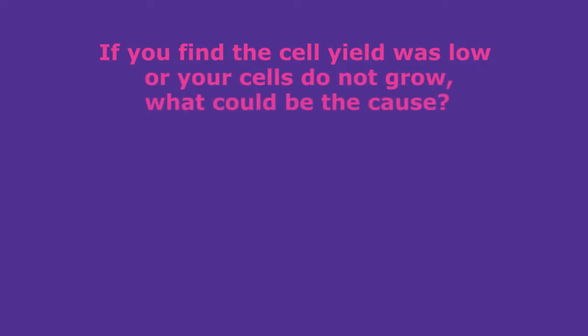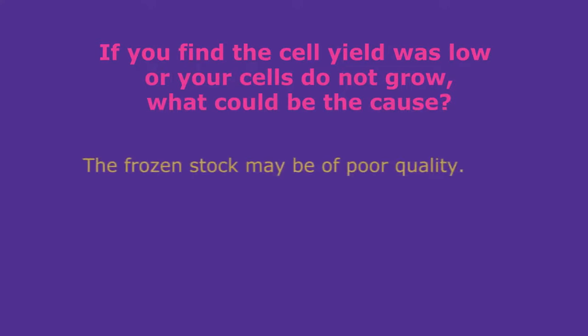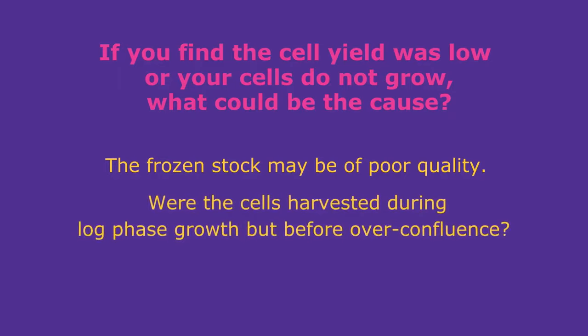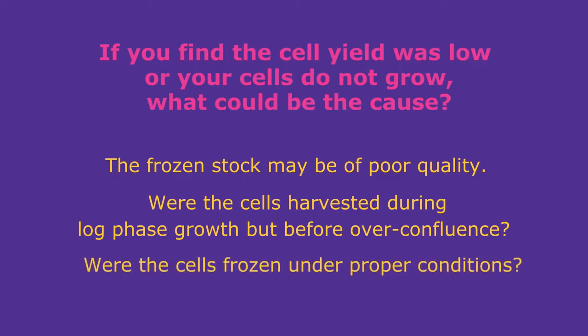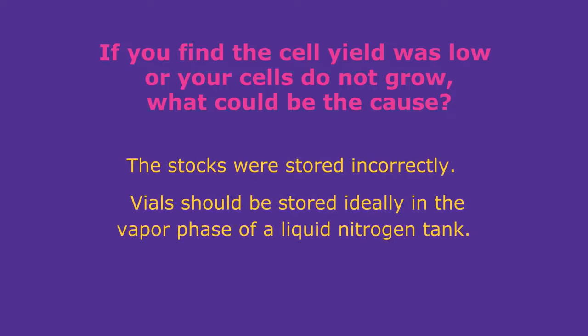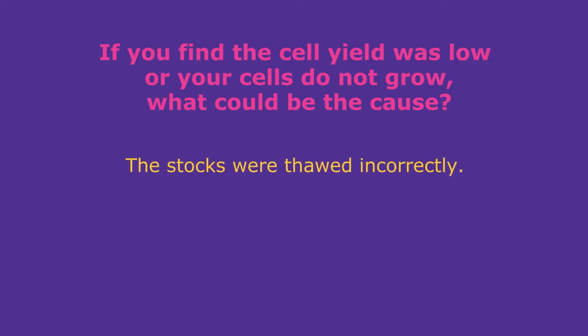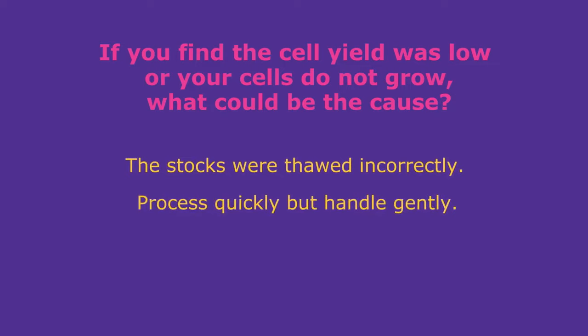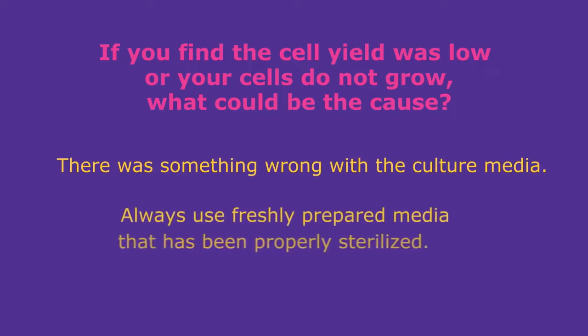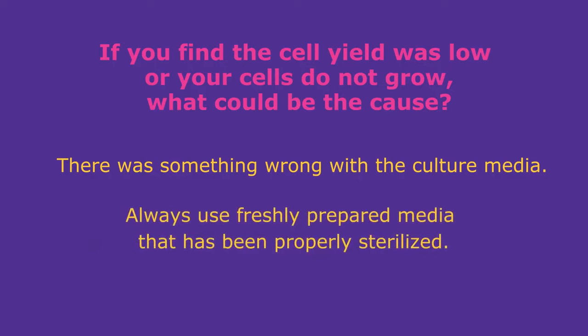If you find the cell yield was low or your cells do not grow, what could be the cause? The frozen stock may be of poor quality — were the cells harvested during the log phase growth but before over-confluence? Were the cells frozen under proper conditions? Vials should be stored ideally in the vapor phase of a liquid nitrogen tank. The stocks may have been thawed incorrectly — process quickly but handle gently. There may also have been something wrong with the culture media; always use freshly prepared media that has been properly sterilized.